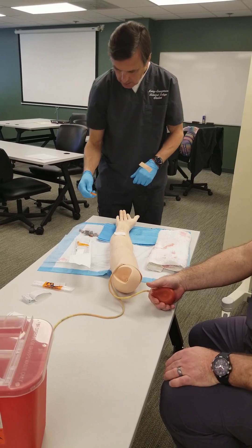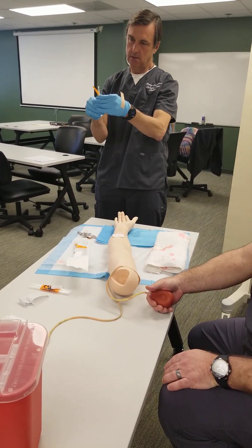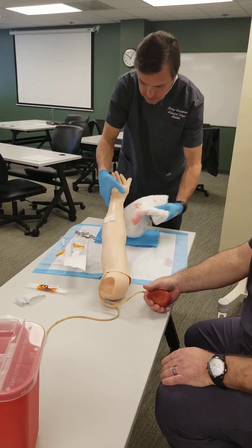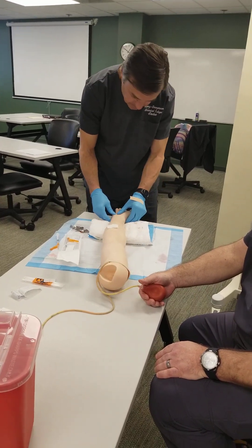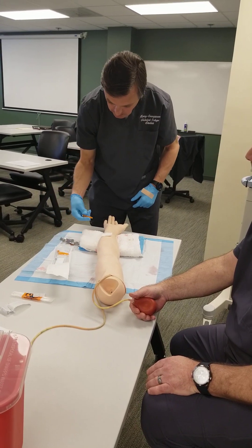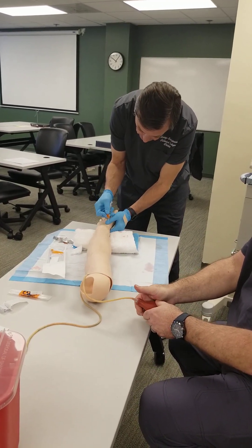I'm going to take the needle. First, I'm going to check to make sure the plunger's up — it is, it's good, it won't give way. I'm going to uncap it. First of all, I'm going to hyperextend Mr. Johnson's wrist at about a 30 to 45 degree angle. Got that ready, sterilized, uncap it like this.